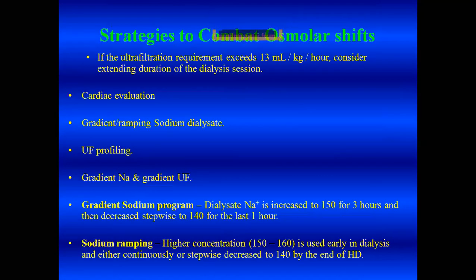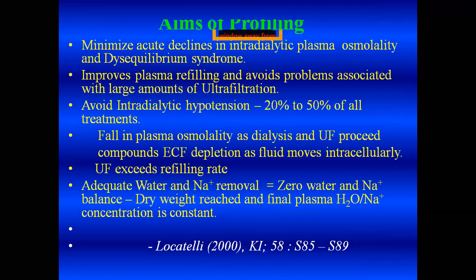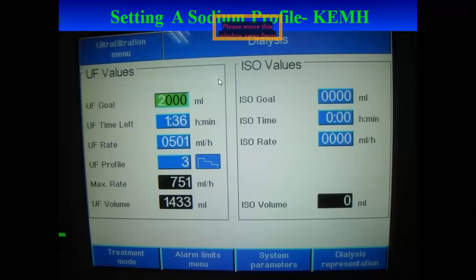We try to combat osmolar shifts by individualizing the dialysate sodium or by doing something called sodium profiling. Today, machines allow us to profile both the sodium and the ultrafiltration rate, and some, like the Allon machines, also allow bicarbonate profiling. Somebody asked me this question three days ago.